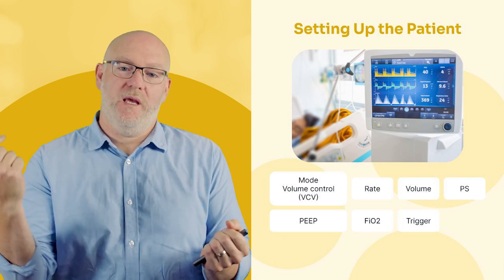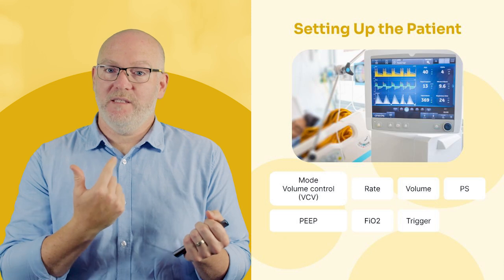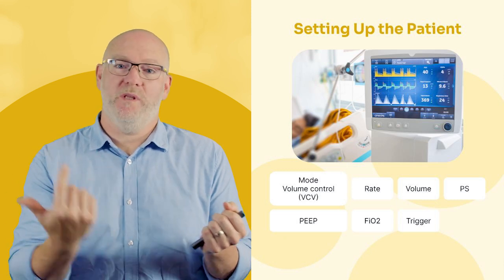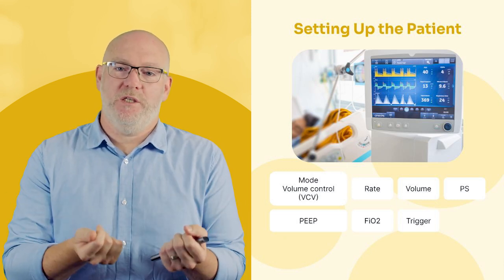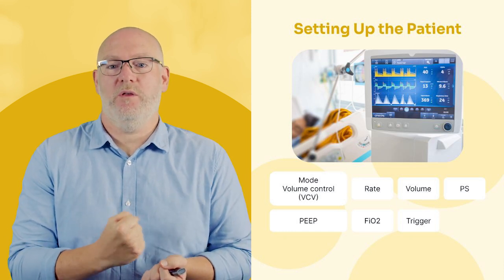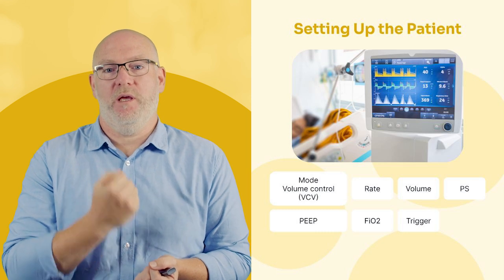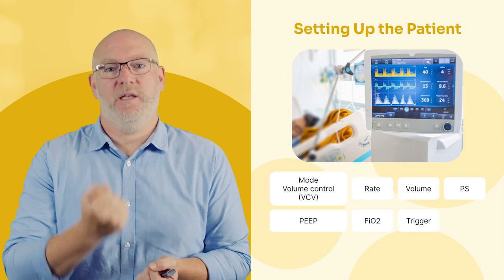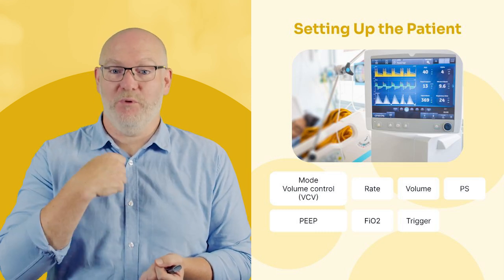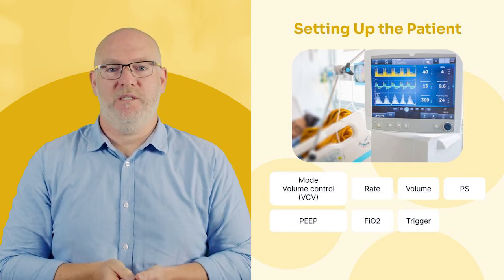All that means is in a ventilator circuit, we have PEEP. There's a constant flow of gas. And if there's a flow of gas, there's a pressure within that circuit as well. The patient either draws some flow out of the circuit, and that's how the ventilator knows that they want a breath, or in drawing flow, they drop the pressure momentarily. And the ventilator is watching for that, and that's how it knows the person wants a spontaneous breath. And when they trigger, they get pressure support, and that's a spontaneous breath.